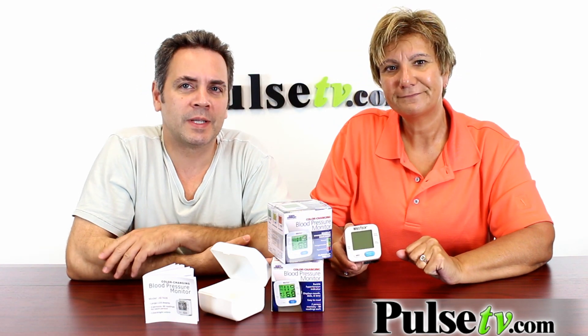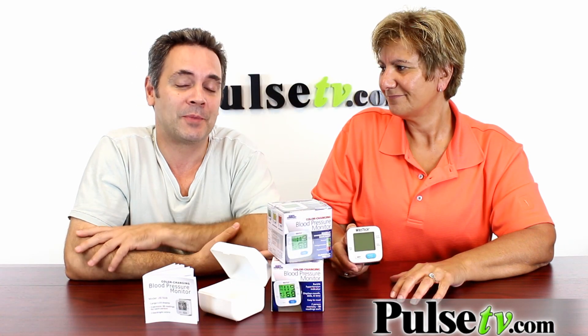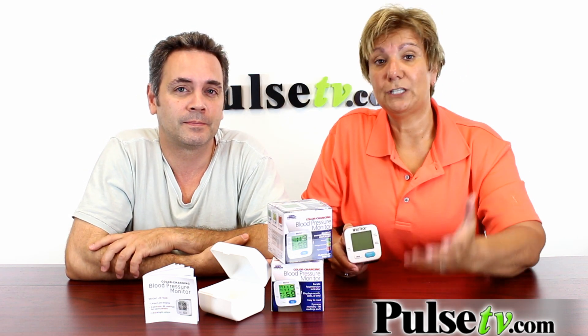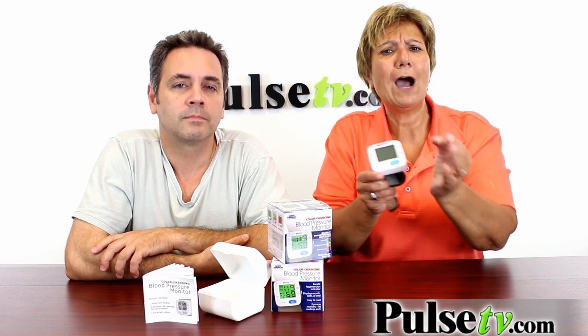You know, what we notice is that the measurements seem to run a little bit high, so if it gets into the red for you, I wouldn't go running to your doctor, but it might be something you're going to want to check daily, maybe every other day, just to keep an eye on it. Here's a really good tip: when you go to your doctor, have them take your blood pressure, then put this on and do it, so you'll know how off it is from your doctor's readings.